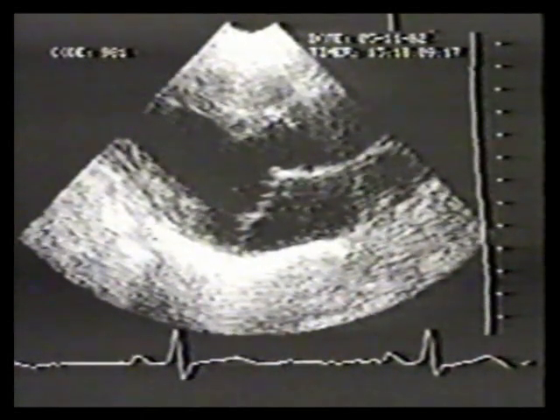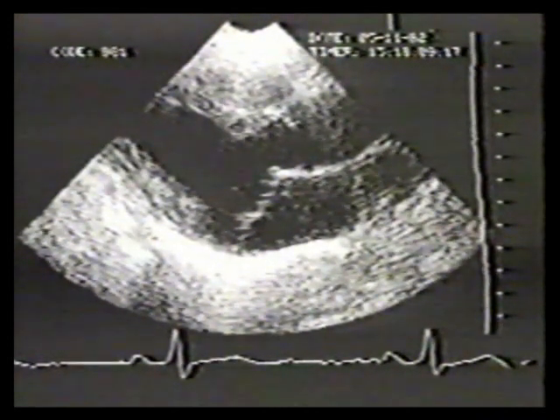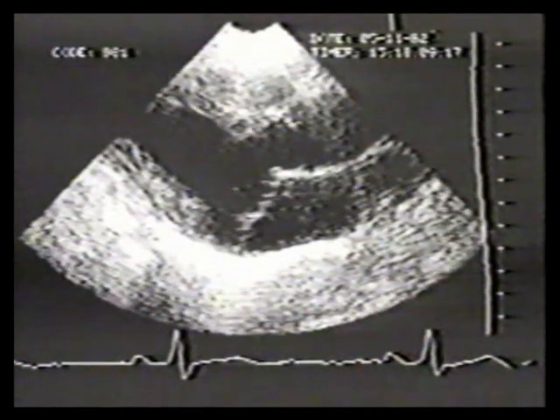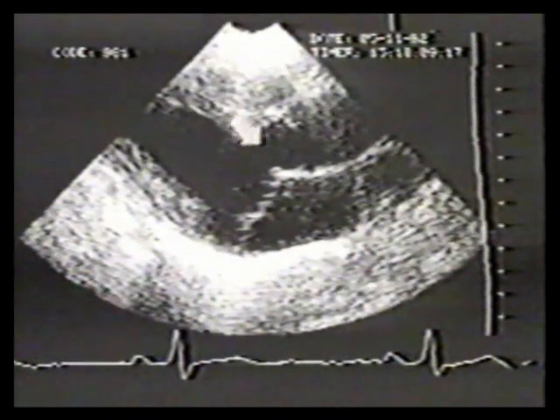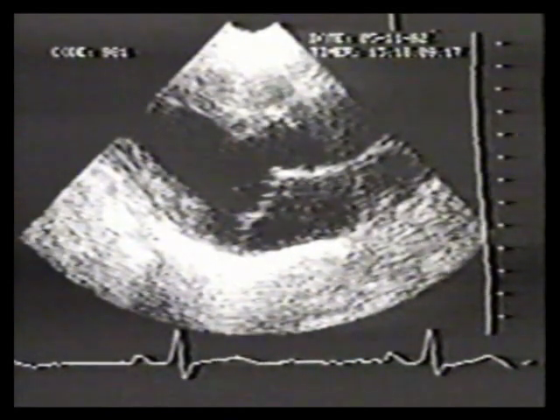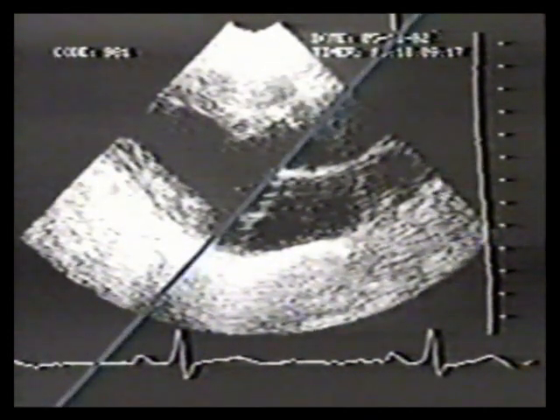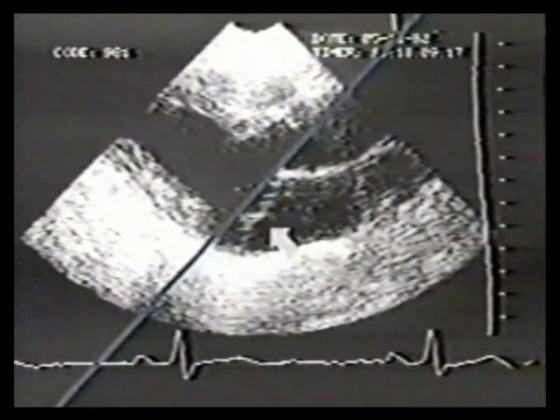We will now discuss mitral valve prolapse, the leading cause of mitral regurgitation in the United States due to myxomatous degeneration. In a parasternal long axis still frame in systole, prolapse is determined by whether the closed mitral leaflets have broken the plane defined by an imaginary line from the base of the anterior to the base of the posterior leaflet. In this case, both leaflets move beyond this line into the left atrium — prolapse is present.